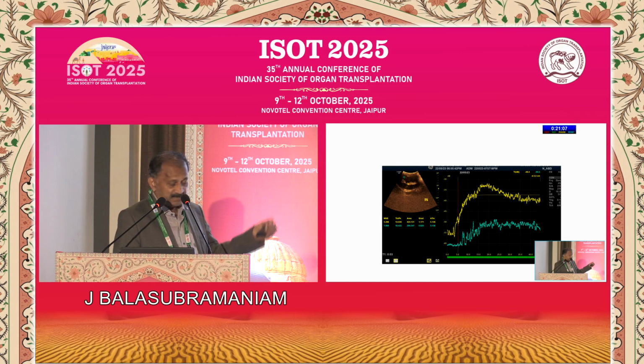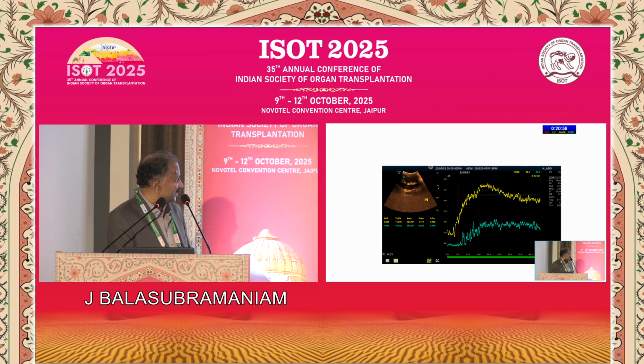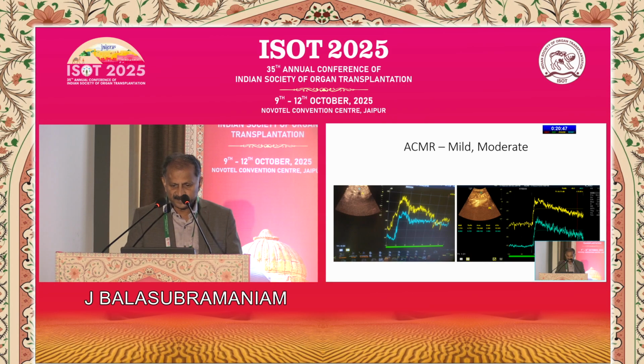So this is obviously an abnormal one. This is actually a calcineurin inhibitor toxicity, very high levels, and you see that because of the vasoconstriction, I guess, the intake by the arteries and the tissues is much slower, and they stay. The washout is also slow, and the diagnoses given above are not very definitive. It is empirical only, but these are cases and these are the patterns I could pick up.